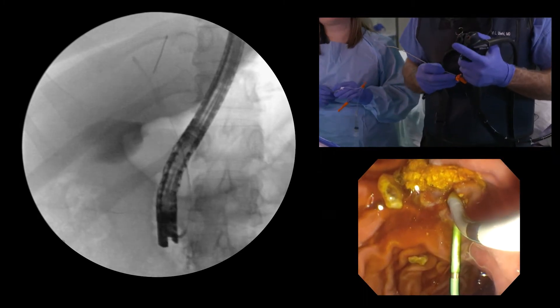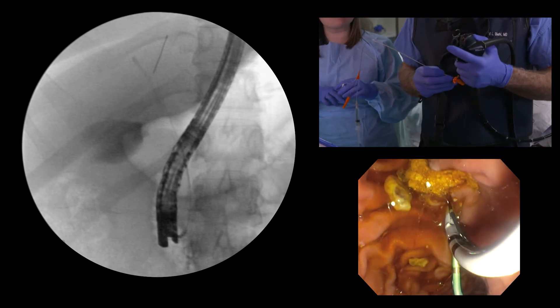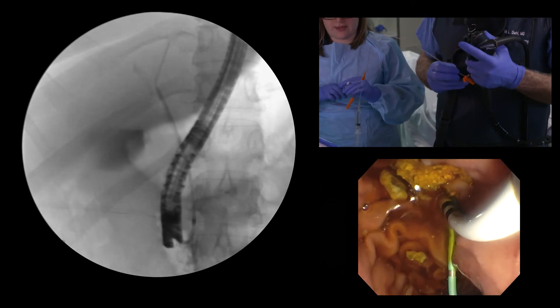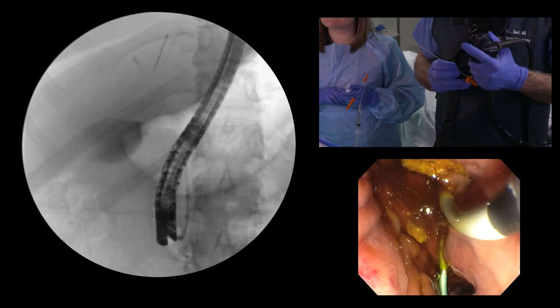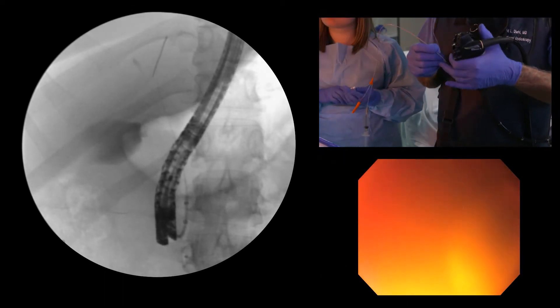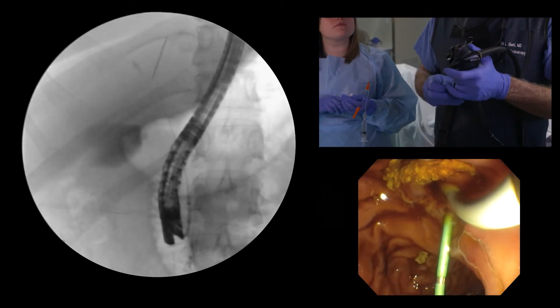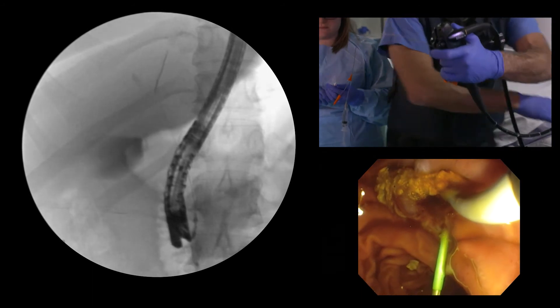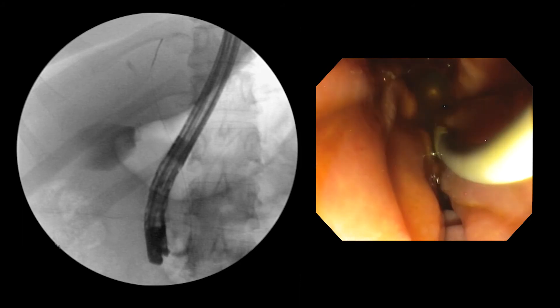Now I'll go up close to the bifurcation. Inflate here and then keep it live. There's a maneuver to pull the stone which I'd love to demonstrate here. I'm pulling the balloon down low, but not all the way out — I'm holding it against the scope. And then if I push the scope forward, you can see it makes the balloon come straight out.